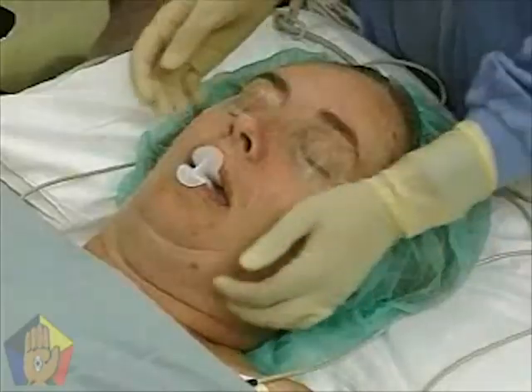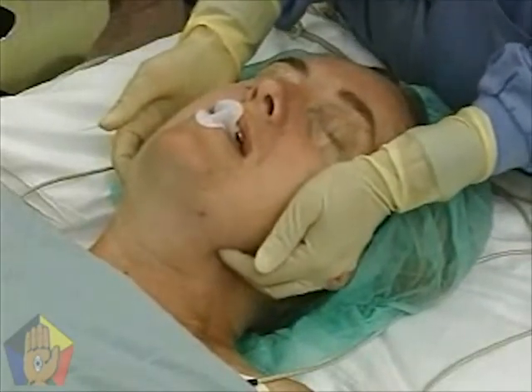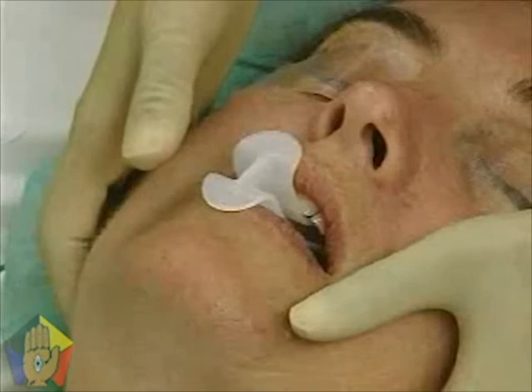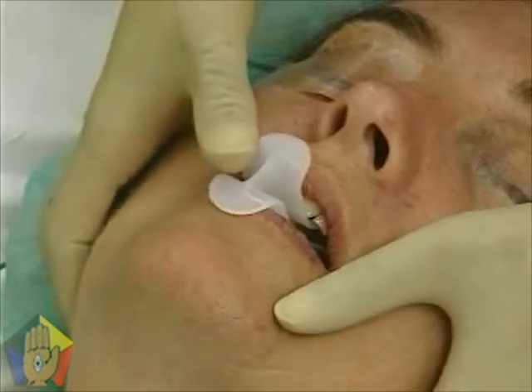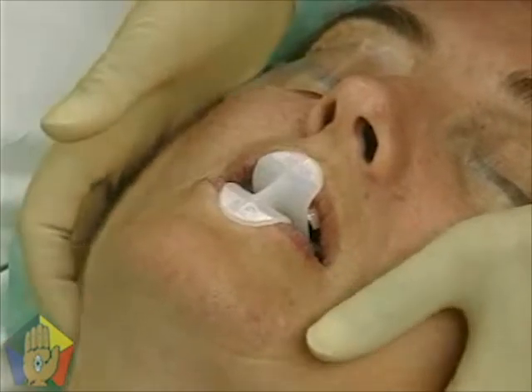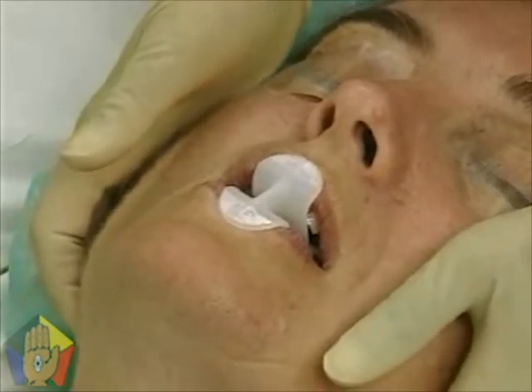Perform the jaw thrust maneuver to lift the tongue off the pharyngeal wall. Now tap the airway down the last 2 centimeters so that the curve lies beyond the base of the tongue.